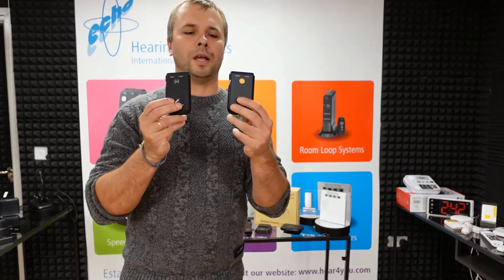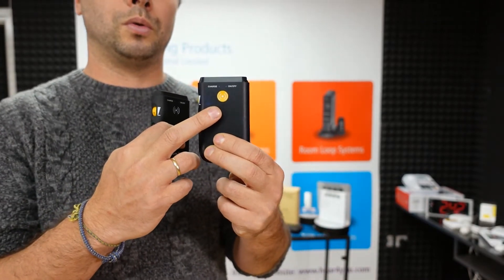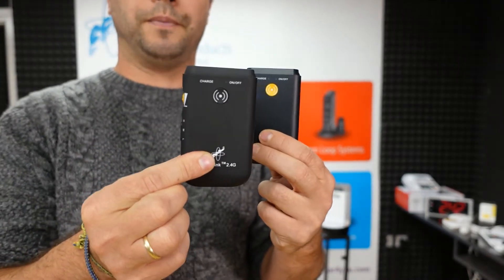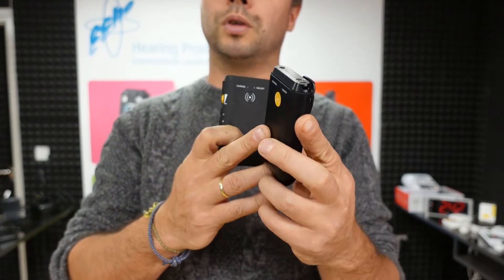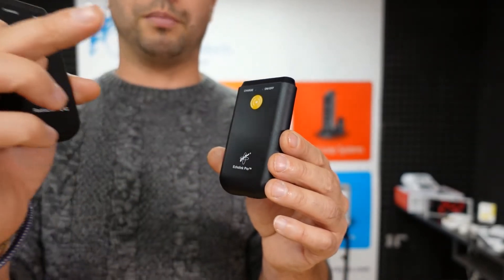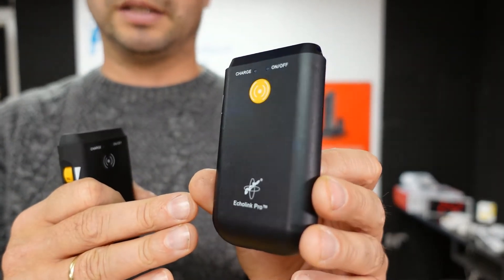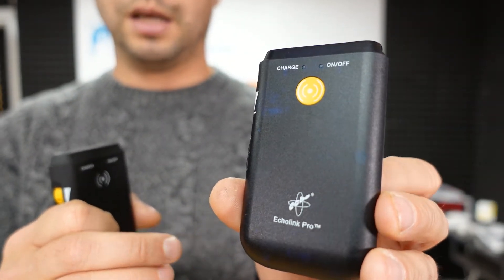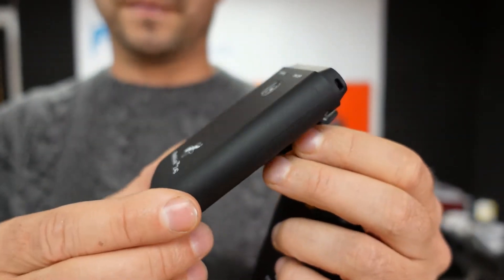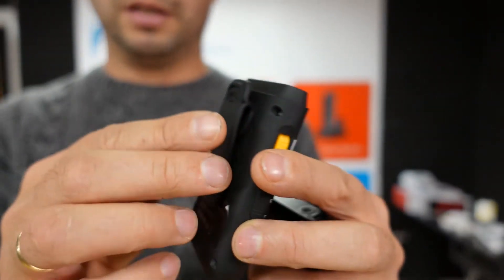Another small difference between RadioLink and Echolink Pro is that on the Echolink we changed the microphone button color to yellow, so it's more visible for sight-impaired people, whereas the RadioLink still has a black button. Also, because the Echolink's plastic is semi-transparent — to allow the infrared signal to pass through — we couldn't use any paint on it, so it's standard clear plastic. With RadioLink 2.4G the surface is covered with a nice rubber finish which is really nice to touch and looks great.